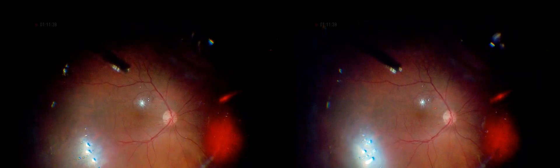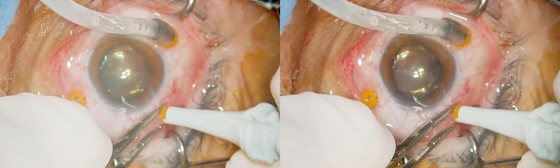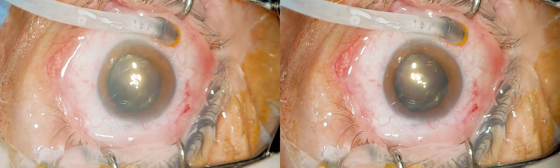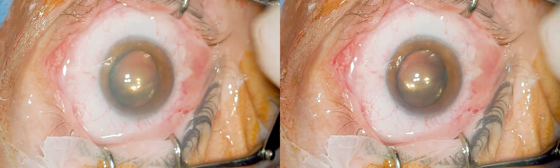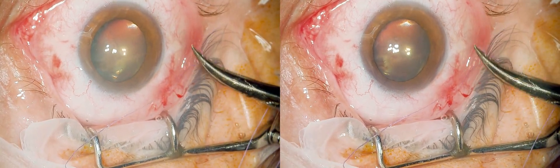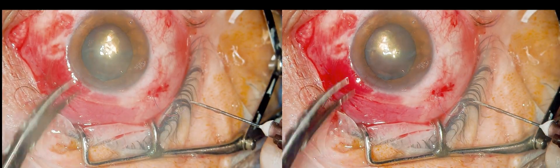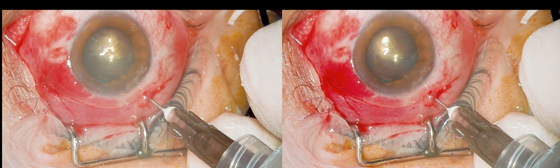The retina is looking good now. SF6 gas is injected through the infusion line following the air-fluid exchange. While purse-string sutures are not always used, they were applied in this case to protect the patient's best eye and vision. Additional diluted gas was introduced through the sclerotomy to prevent any hypotony. The gas concentration was slightly expansile, and the patient was instructed to maintain a face-down position.